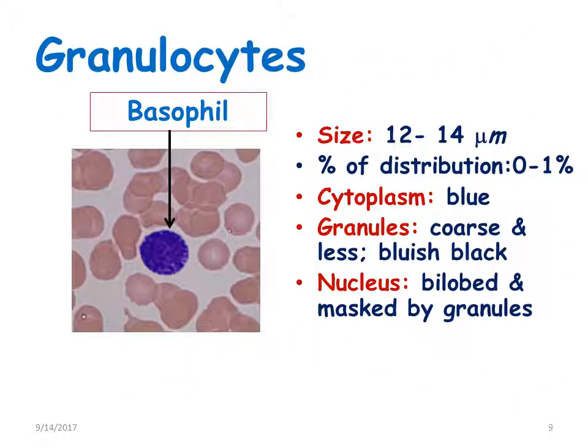The next granulocyte is the basophil. They also have a similar size of 12 to 14 micrometers, with a percentage distribution of 0 to 1%. The cytoplasm is blue in color. The granules are coarse, less in number, and bluish-black. The nucleus is bi-lobed and generally masked by the granules.